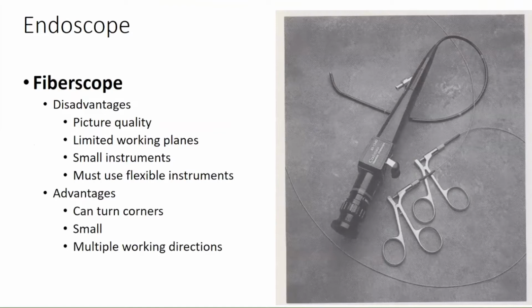So since it's moving around too much, it can be to your advantage that you can reach into small spaces and through tight foramens, or if you want to navigate corners, especially during a choroid plexus coagulation, it comes in really handy. But it can be hard to manipulate in terms of working planes if you're actually doing any dissections or any additional maneuvers.